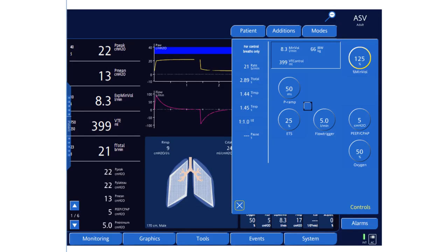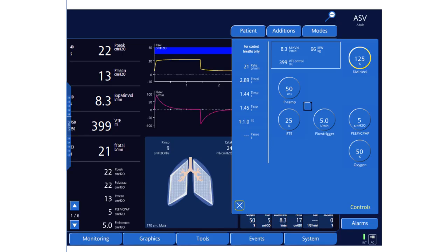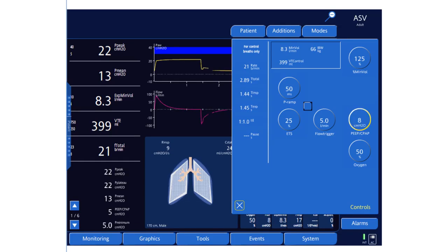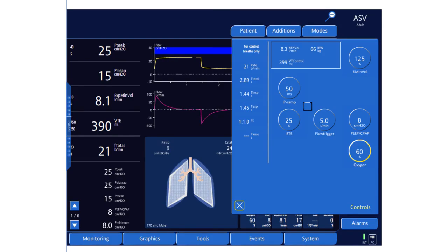Then you can decide how fast you want to go from the PEEP level to the peak inspiratory pressure level — this is the ramp. Let's keep it at 50 milliseconds. Then you decide how much PEEP to give the patient; I'll keep it at 8 here, though you should use more for a patient with ARDS. FiO2 will be set at 60% for this simulation.